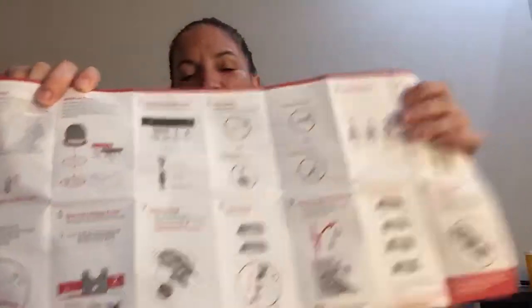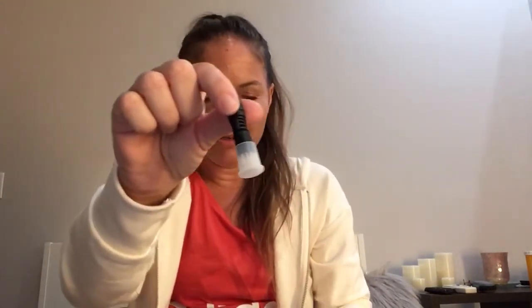I've done this so many times I don't need the instructions, but to do a clear demonstration I'll read them. Step one: open pouch number one, the black pouch. Inside you'll have your shaker and your little collection piece — that's where you put the blood. When you do your finger stick and get a drop of blood, fill it all the way to the end. Don't underfill or overfill, similar to what we do with test strips. It doesn't take much more blood than a test strip requires.